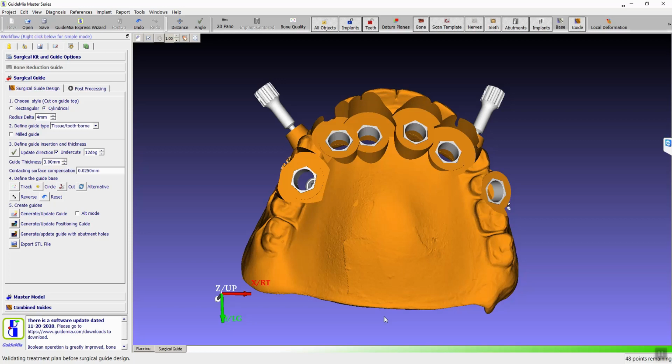When's your Chrome-like version coming out? We're actually quite delayed on that project because, one, I kind of don't want to do exactly the same as Chrome does. We had a discussion last year, and we got different approaches, but it seems like we still end up with something almost the same as Chrome guides.